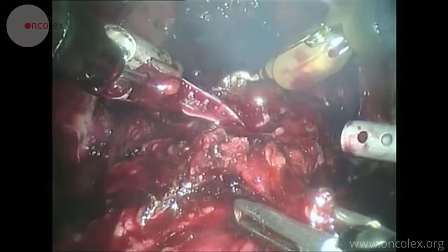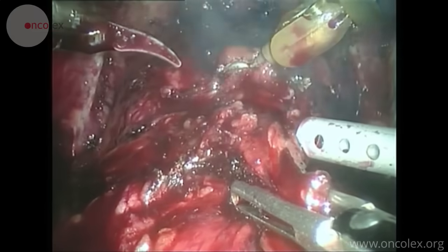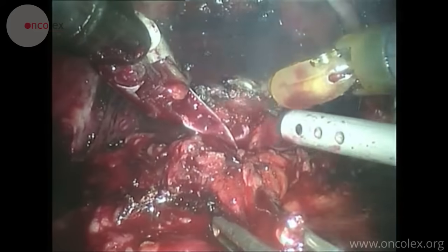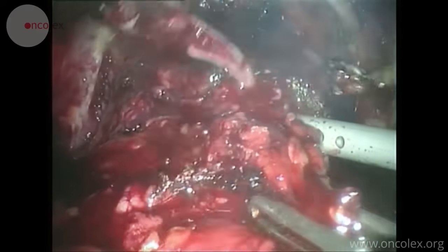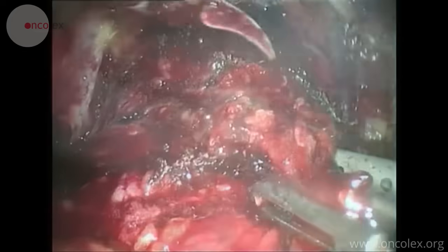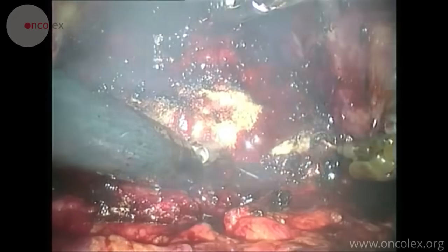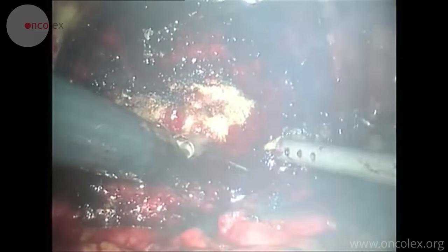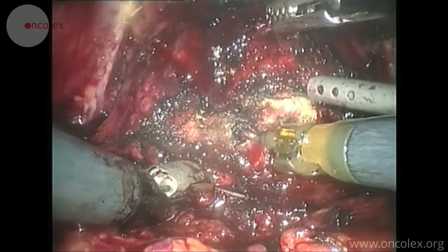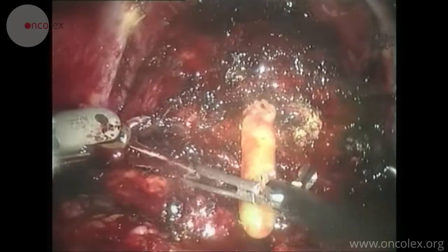The surgeon has now begun to cut between the prostate and the front of the bladder. The assistant is retracting the bladder to more easily view the contour of the prostate and find the correct dissection path. The surgeon now approaches the urethra. The catheter, which the assistant holds up with forceps, is now visible.